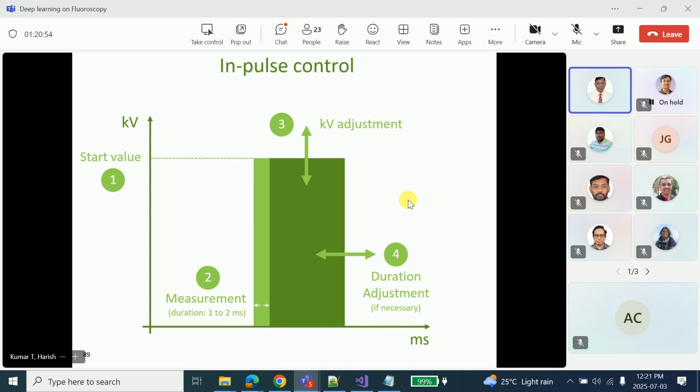Why is it important? You have heard all these things, and you were shown images of contrast and everything. Why do we want to avoid that 2 second lag? Why is that so important? Two seconds is not just about exposure, it is the time of capture. So you might miss whatever is relevant. You may miss the pathology.